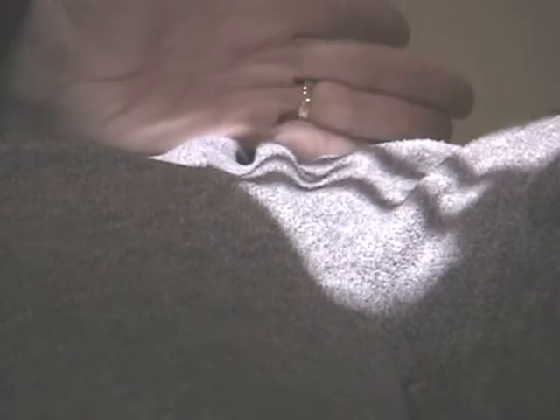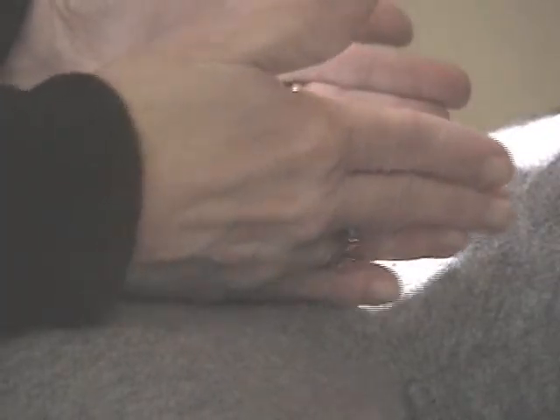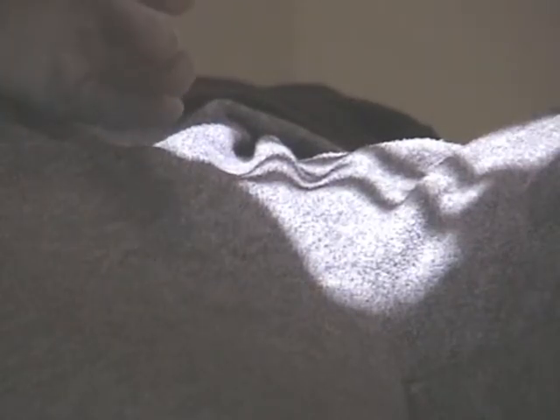Okay. Now look at the lower edge of the light, and it's below the pubic bone, but it's not down into the X-ray tabletop. And this top portion of the light is not too far above the ASIS. If you've got a 7x7 approximate field, and you've included the ASIS, and you've included the pubic bone without including too much of the tabletop, that's a pretty good indication that vertically you're centered well. Side to side, I'm pretty much midline on this patient. I'm not touching, I just have this visionary line. MSP to the center here.